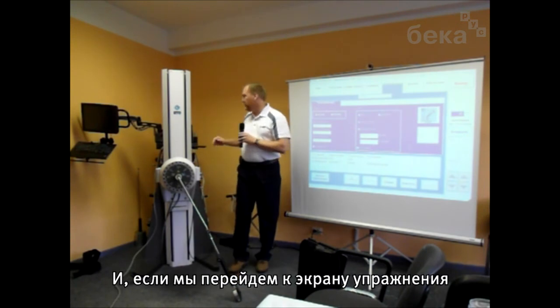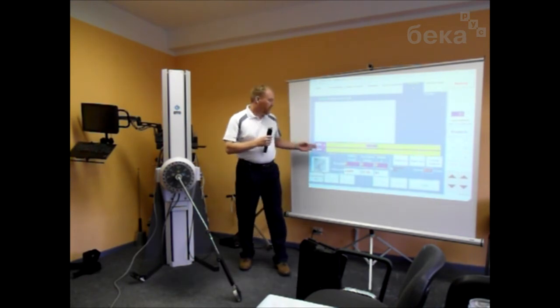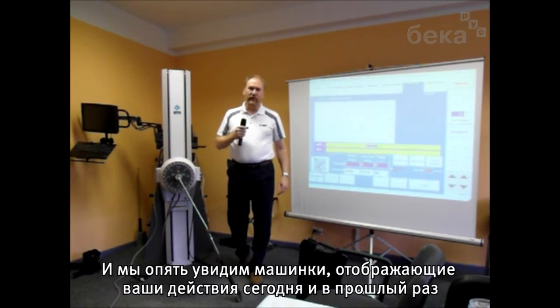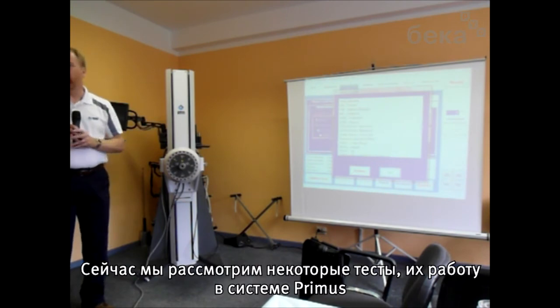And if we go back to the treatment screen, if we were coming in for the next day, it shows previous session, again with your race cars to provide feedback as to how well the person's performing today compared to the previous day. So let's take a look at some of these tests and how they're performed on the Primus system.